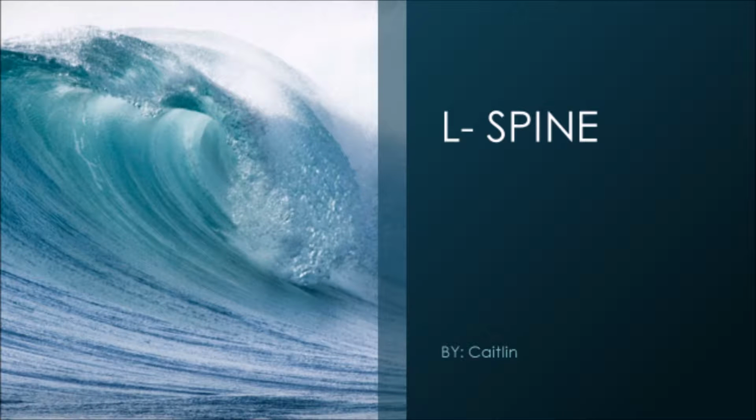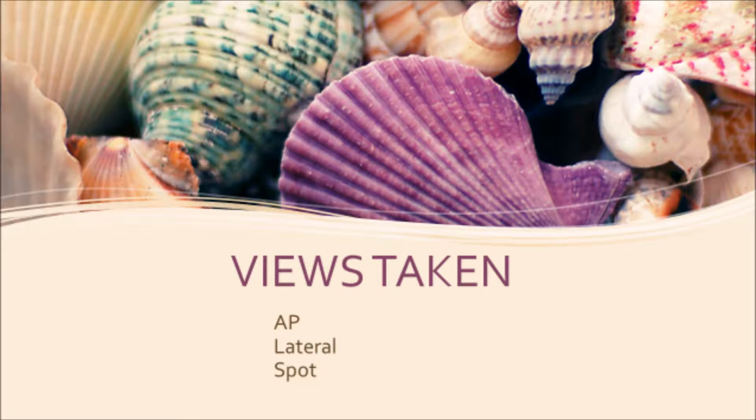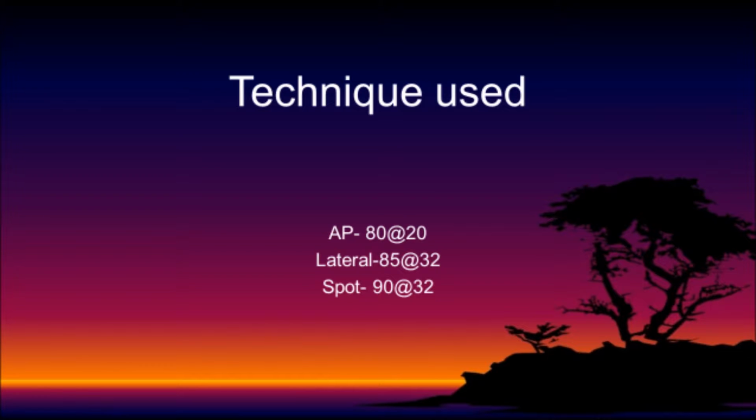My presentation is on the L-spine. The views taken are AP, lateral, and spot, and they are the same for my site. Here, you can see the average technique used for each view.